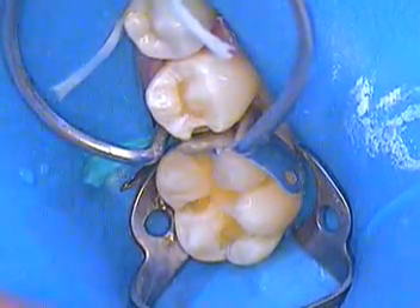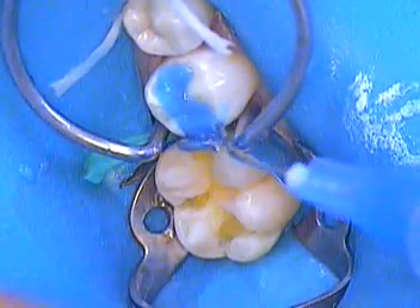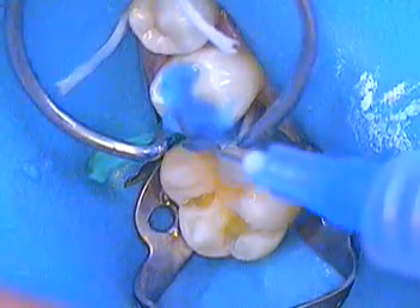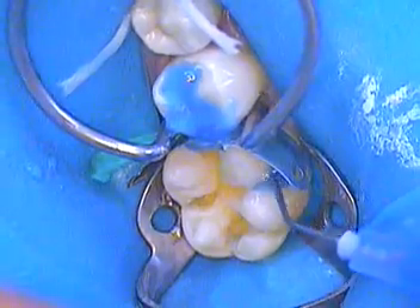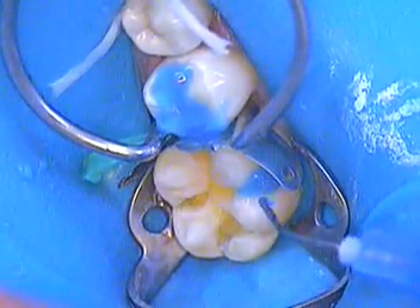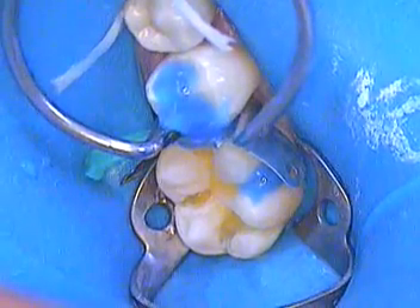We'll etch that adjacent tooth. Now that we have everything isolated, there's no contamination whatsoever. Let's go ahead and get that etched. I'm just re-etching this buccal groove just to make sure I have it etched.